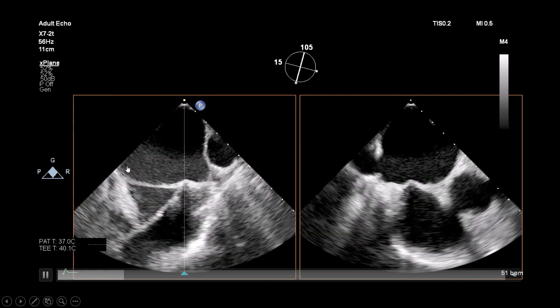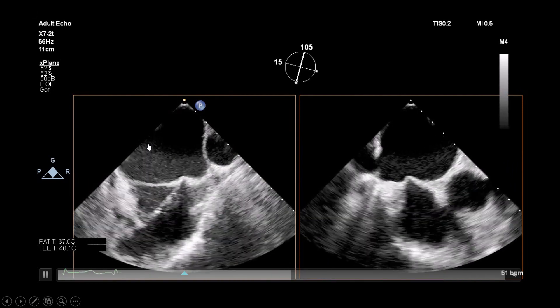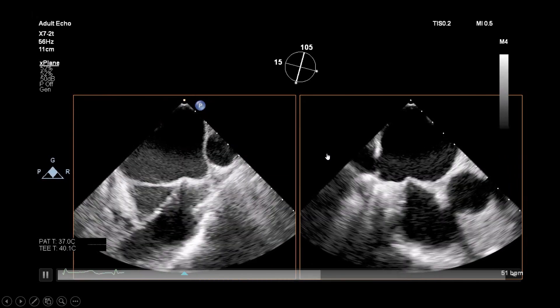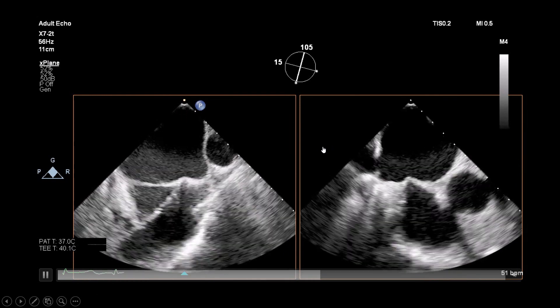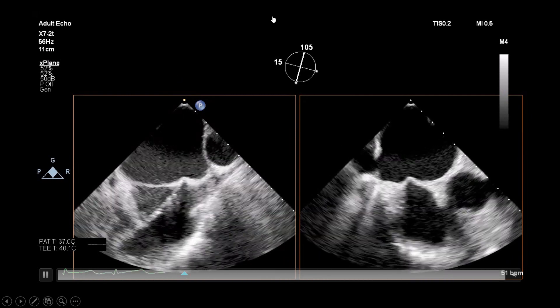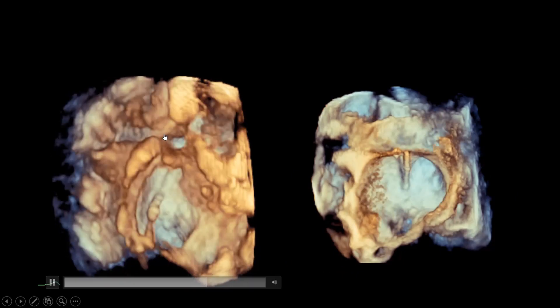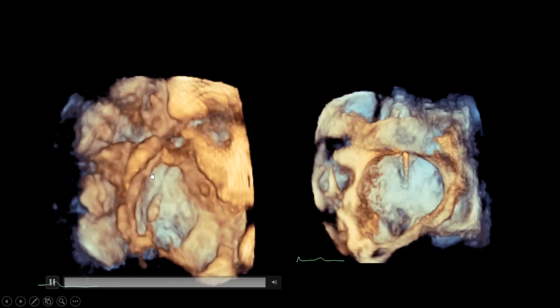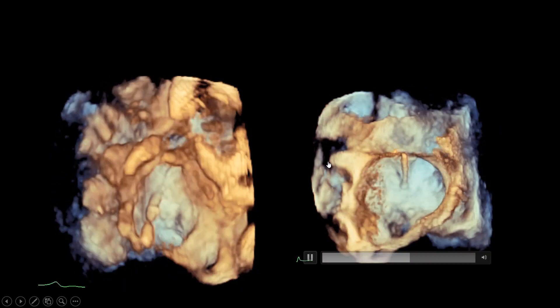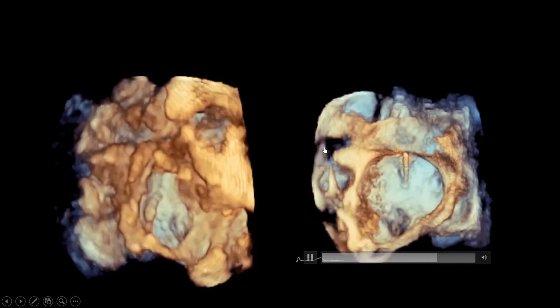Now, transseptal puncture using X-plane: the catheter is coming from the IVC, tenting the superior portion of the septum. Putting an X-plane over this gives you the anterior-posterior short axis basal view. You can see we are tenting in the posterior part of the septum, which is a very good position for this particular procedure. After puncturing, the 3D image shows the catheter coming through posteriorly and superiorly. Looking at the left atrial aspect of the septum, you can see the catheter coming through toward you.